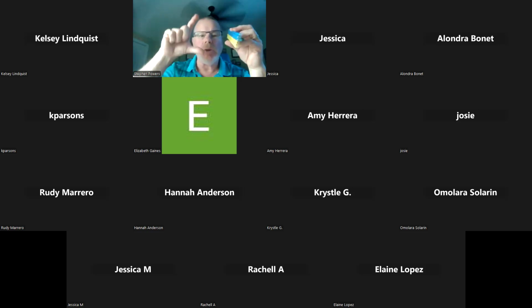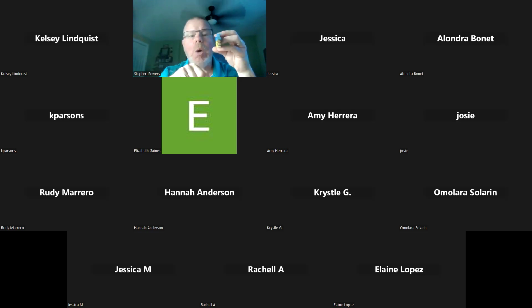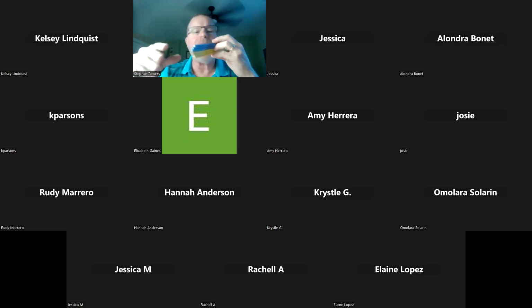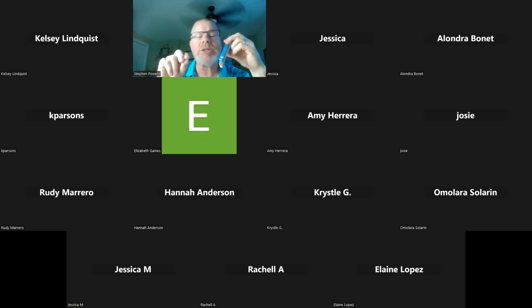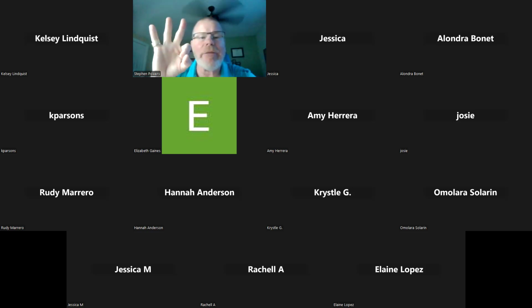So it lets you drop your TR and only knock these guys down, let's say 70 degrees, and you'll get good signal to noise. You'll get good T1 contrast. Your scan time's a little bit less. You get good T1 contrast at 3T. So it's called an Ernst angle. I don't really go over it because I've never heard anybody asking about Ernst angle on the registry. I'm not saying it can't be there, but I've never heard of it.